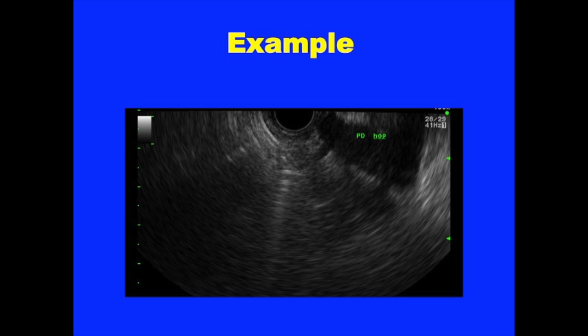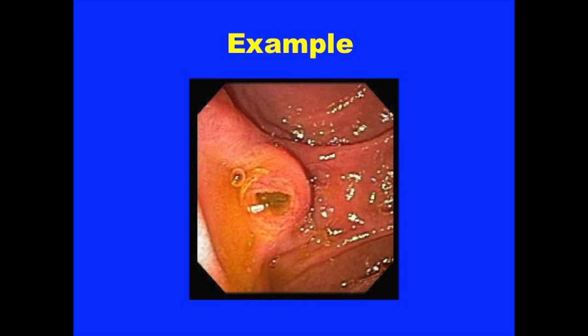And what is very nicely demonstrated is that this runs completely through the wall, through the ampulla. So in this person, it does not make sense for that to be chronic pancreatitis and to have that duct dilated there. And what we are seeing is actually that this person has a classic fisheye appearance to their papilla, and we are seeing the duct come out right at the orifice of the papilla and extruding mucus, and this was a main duct variant of IPMN.